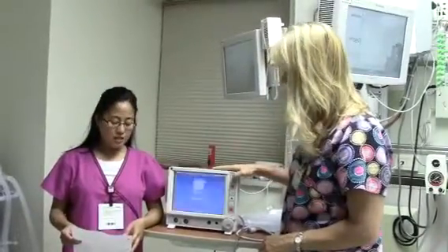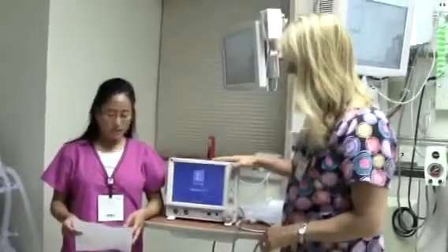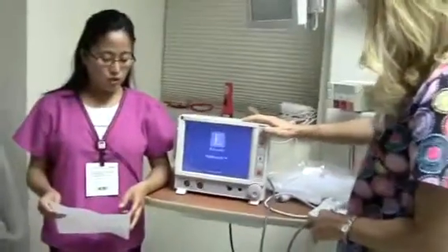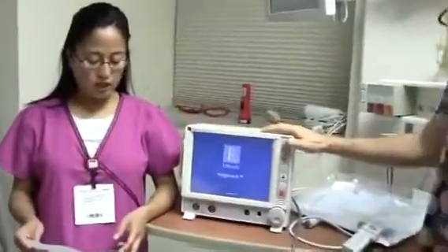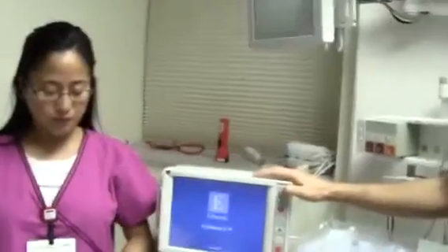Hi, my name is Josie. My name is Ethel, and we are here to demonstrate how to set up the continuous cardiac output and SVO2 monitoring on a patient arriving from surgery.